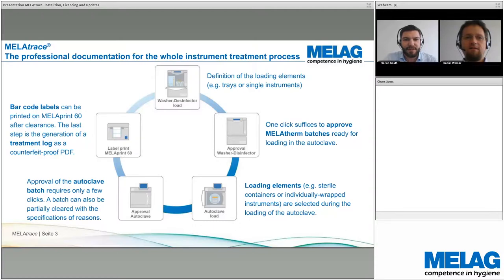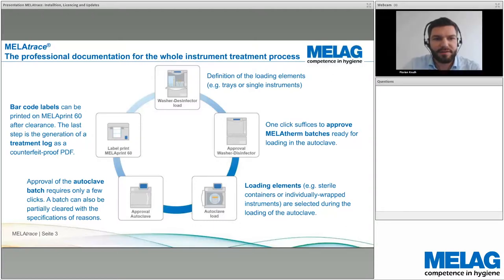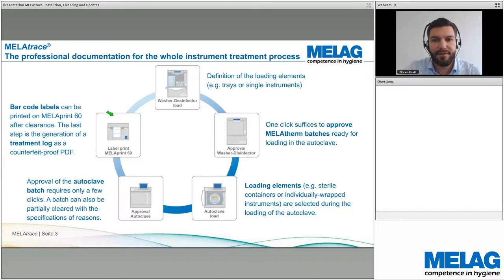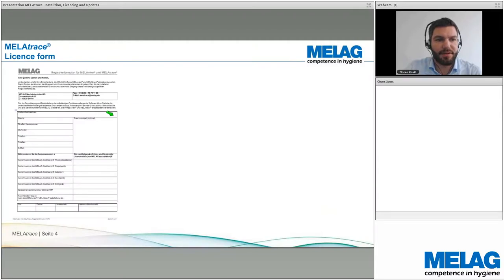MelaTrace is a documentation software for the complete instrument treatment process. It starts with the load of the washer disinfector. After finishing, you can approve the washer disinfector load. After that, you load the autoclave, approve it, and at the end you can print labels for your wrapped instruments — giving you a complete documentation of the entire instrument treatment process.